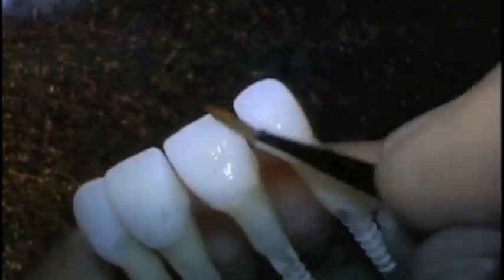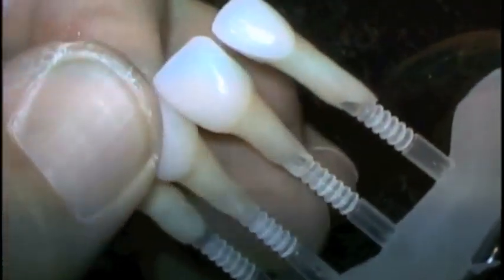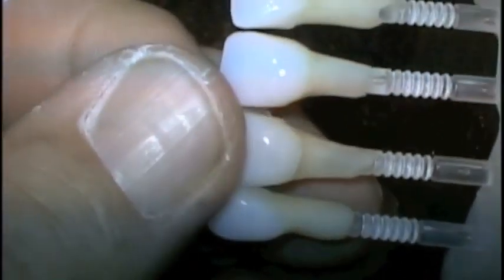We'll start off our staining process by dampening the surface with a little bit of stain liquid. And one thing that's really important is to make sure that you have stain liquid underneath between the restoration and your composite dies, because it makes a big difference in the amount of show through of underlying color, and that plays a very important role.